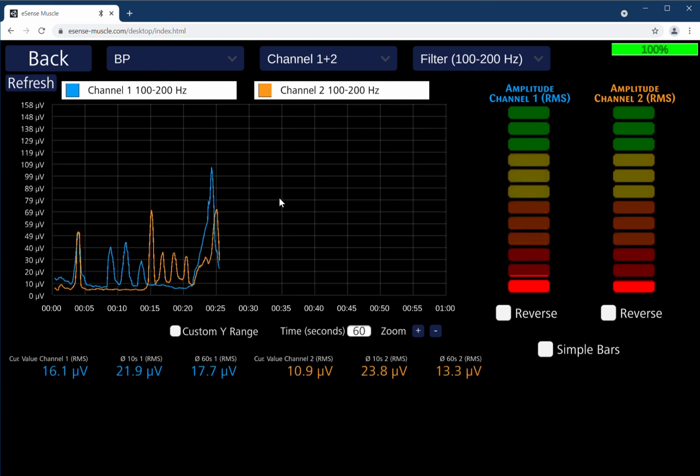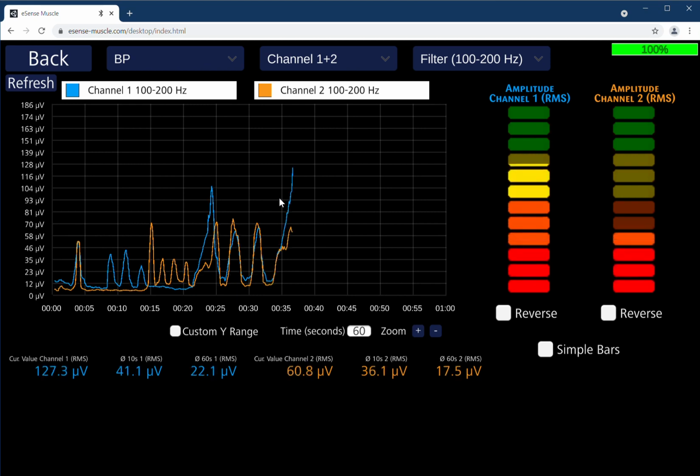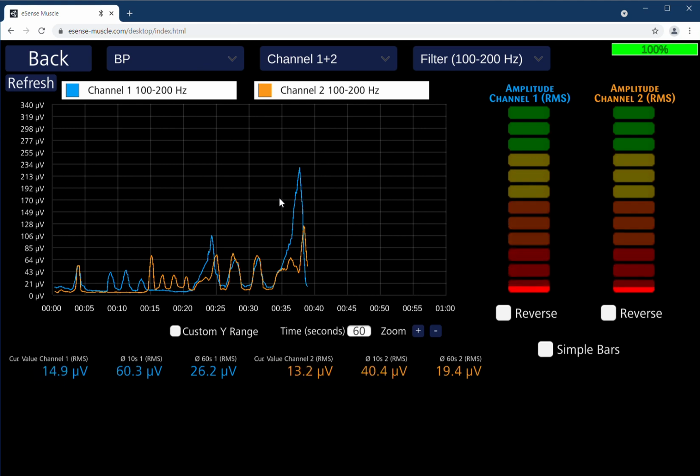And again, symmetry, synchronous. And it's not so easy to always, so I can play with it here. You can see how strong you can contract, and you see if you are already having a tension, you need to lose. You see that you have some numeric values showing you the current values, some averaged values here below. You see these bar charts.